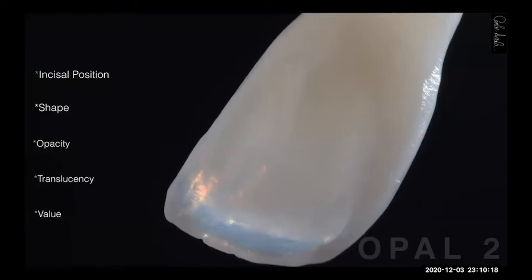So what is the advantage of the scoop technique? One of them is incisal position, because what happens? Let's say you did a diagnostic wax up, right? If you do a diagnostic wax up and then you follow that in your press technique or in your CAD/CAM technique, you have the incisal position.